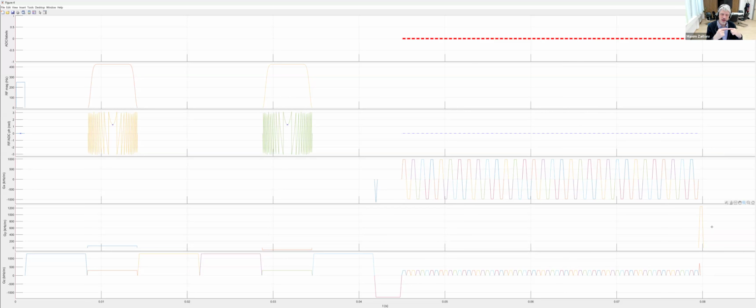So what we have is the possibility to have the gradient be non-zero at the edge of the block. So what you can do theoretically, you can ramp up your gradient, or imagine you would like to have a gradient which would stretch all over your sequence in some kind of totally asynchronous way.